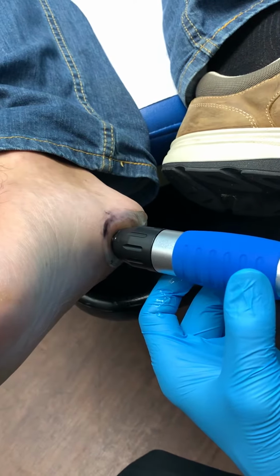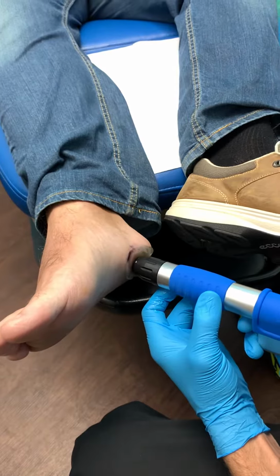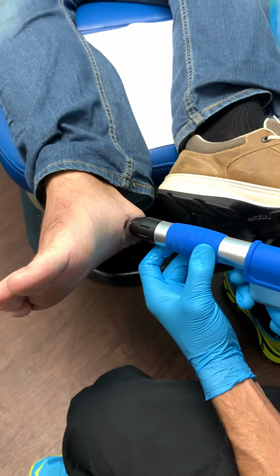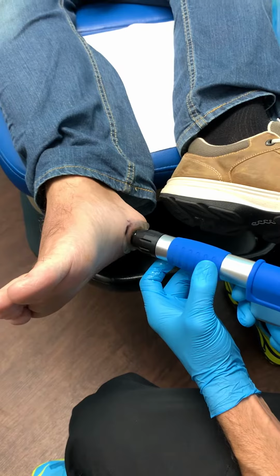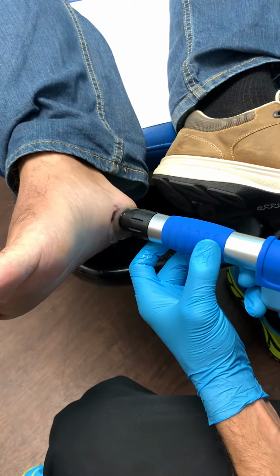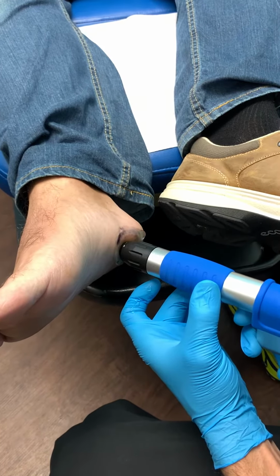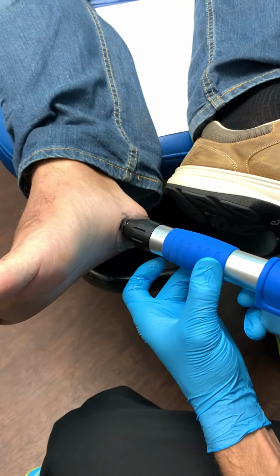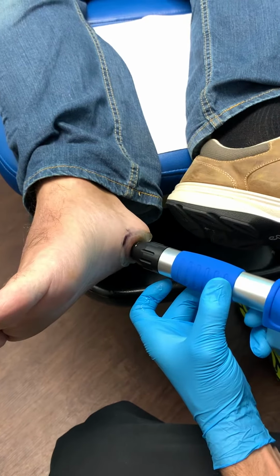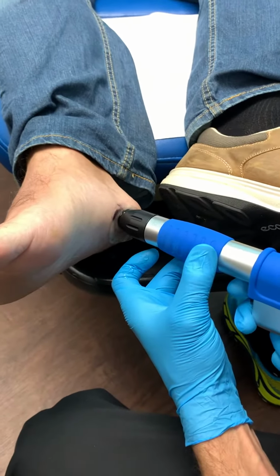Indications, as previously mentioned: plantar fasciitis, heel pain, Achilles tendonitis, any acute injuries, neuromas, inflammation of nerves, any tendon problems. I used to use this alone, and we can, but I noticed that putting a really nice regenerative protocol together is the way to go. Again, it's a series of multiple sessions. This is not a one-time treatment.